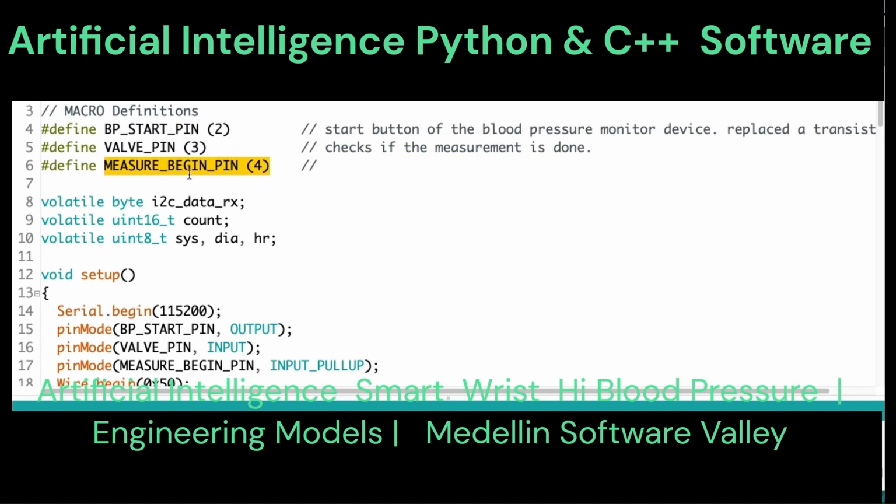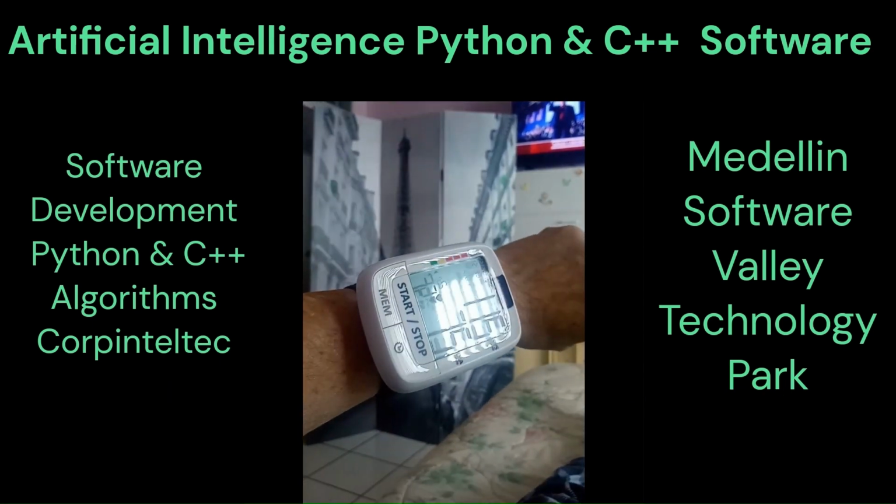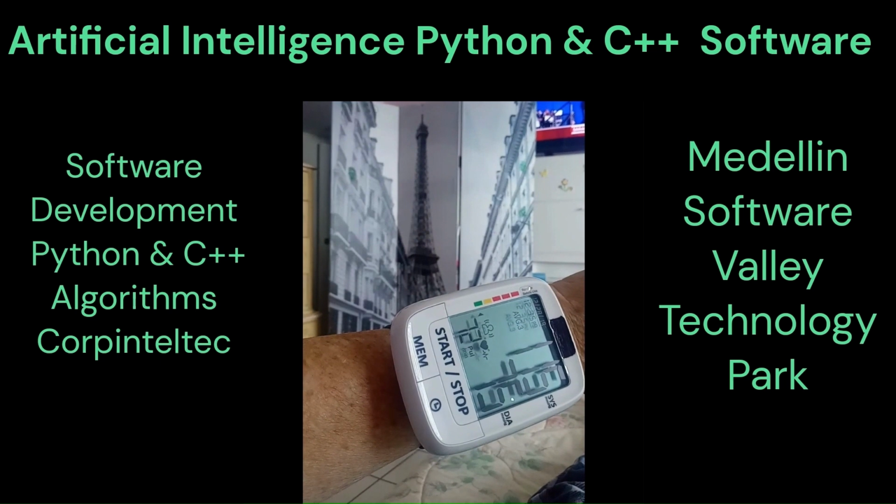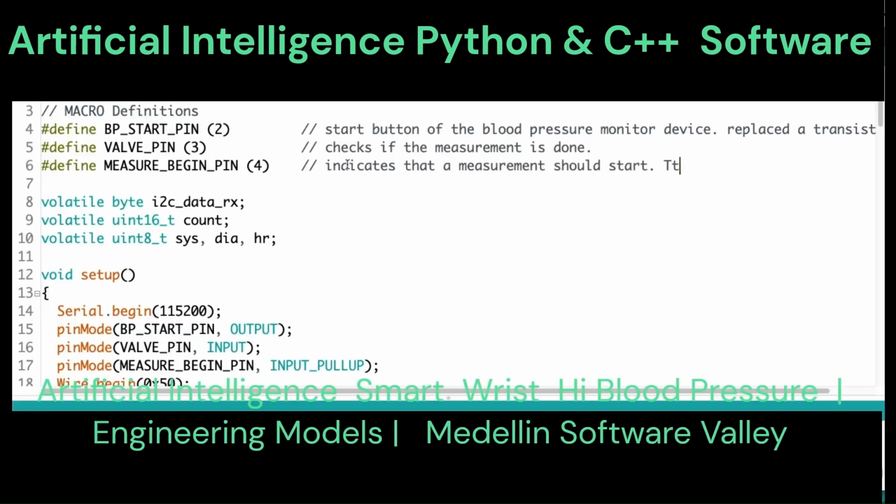The proposed system is based on the oscillometric pressure waveform methodology, and it is combined with Bluetooth technology in order to transfer data to any mobile application.